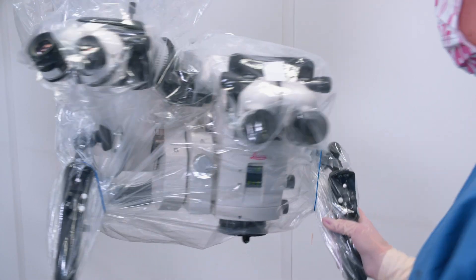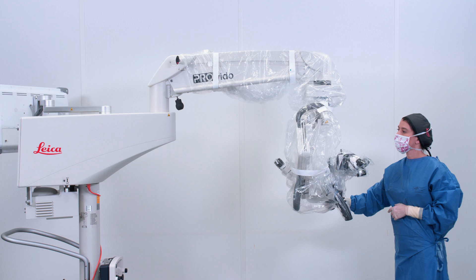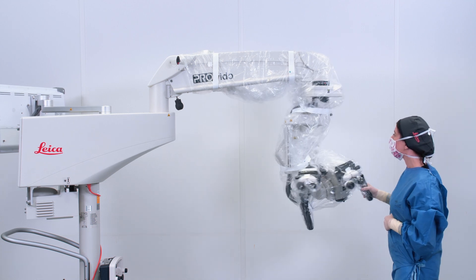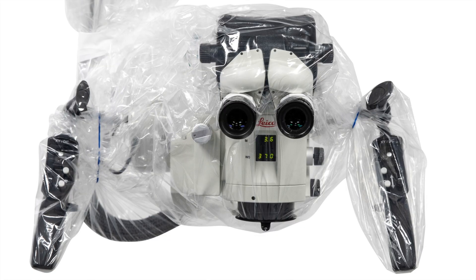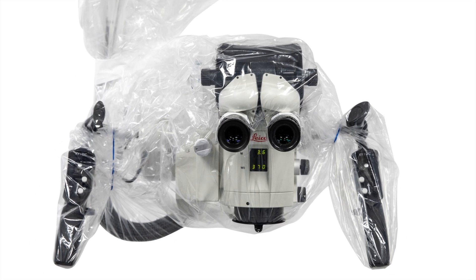Rotate the microscope to ensure that it can be moved easily in all directions. The drape shouldn't interfere with microscope movement. You are now ready to work with the Leica microscope.